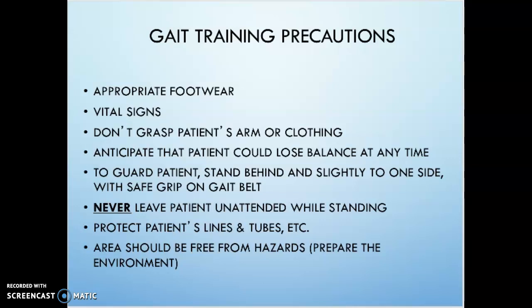We're going to have 2 labs to discuss all of this. On Monday, we're going to go through all the basics, how to fit an assistive device and which gait pattern to choose, and then how to teach a patient how to do all of this. The following Monday, on February 8th, we will practice gait with stairs, up and down curbs, and with IVs, like an IV pole and or portable oxygen.